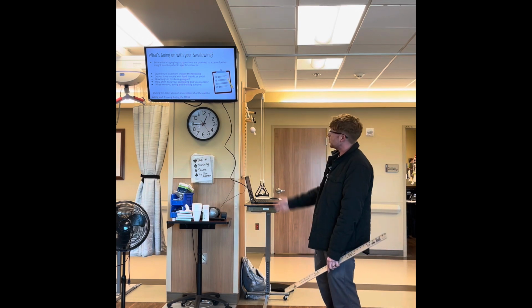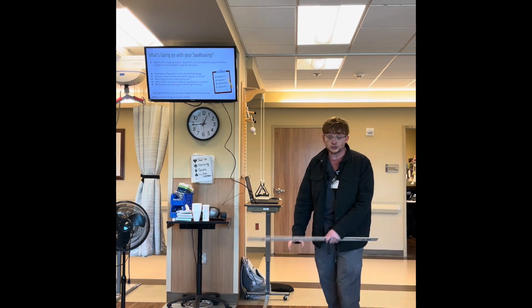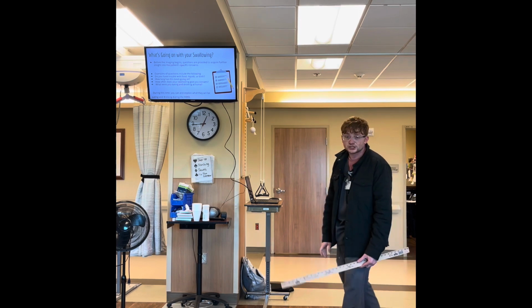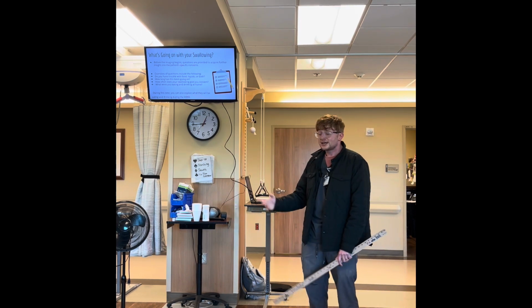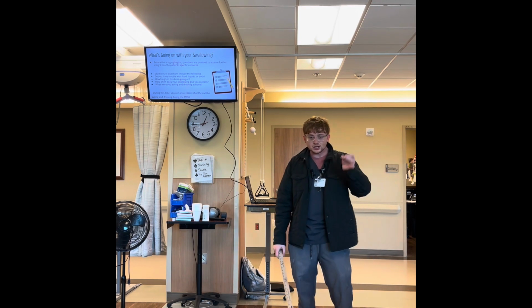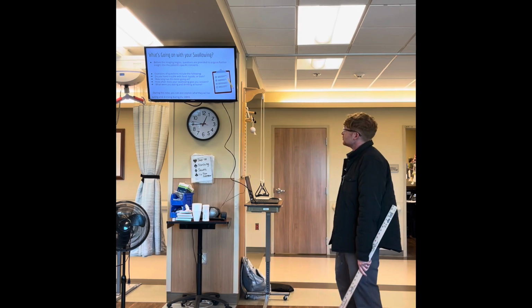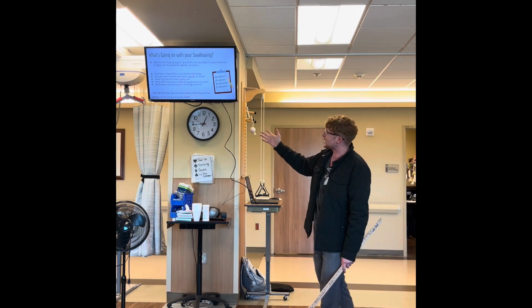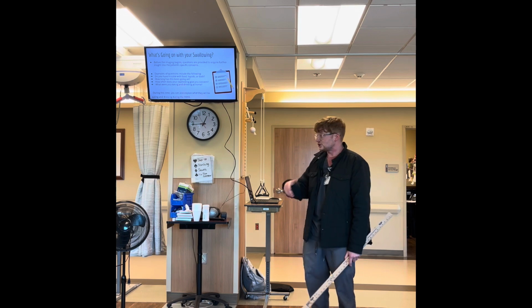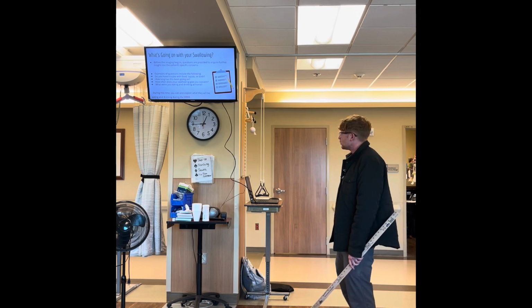So some examples of questions you might ask. Do you have trouble with foods, liquids, or both? You want to know how long it's been going on. You want to establish a baseline diet, what they were eating and drinking before. Because if they tell you they were doing soft textured things, instead of a cracker, you might soften it up with some of the liquid and make it more of a mechanical soft, a softer thing for them. So you want to get a feel for their baseline diet. And then during this time, you're also able to explain what they'll be eating and drinking during the test. I usually do it the same way I just told you all before, going through what the liquids are, a little bit of pudding, the graham cracker.